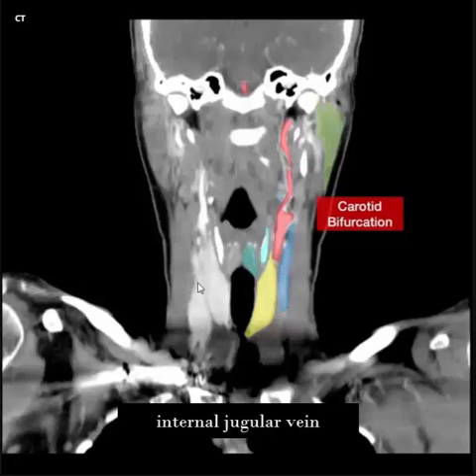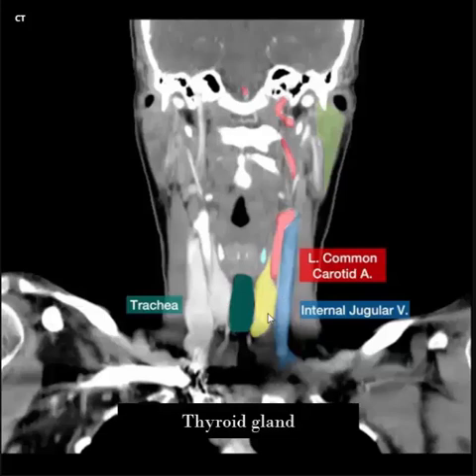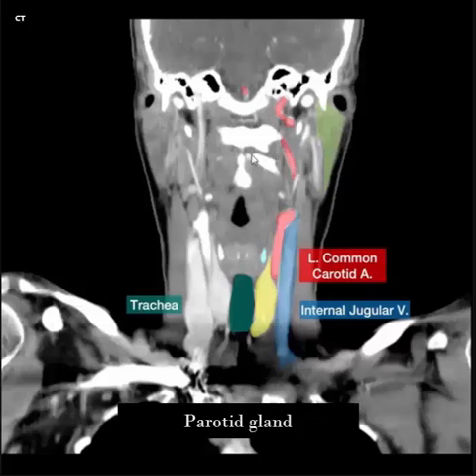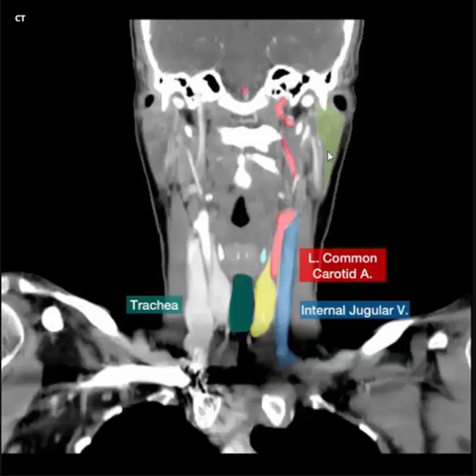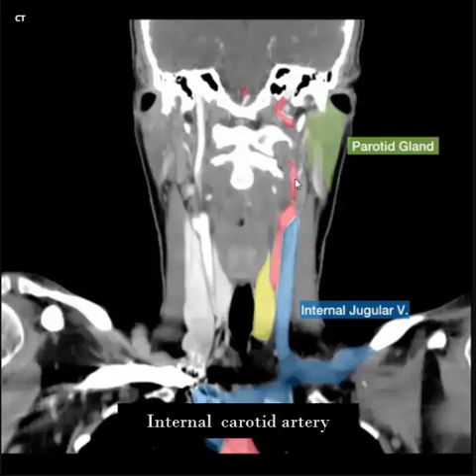Internal jugular vein, right and left. Right and left parotid gland. Trachea, right and left thyroid gland, right and left common carotid artery, internal jugular vein. Right and left internal carotid artery, right and left parotid gland. Parotid gland, internal carotid artery, common carotid artery, internal jugular vein.